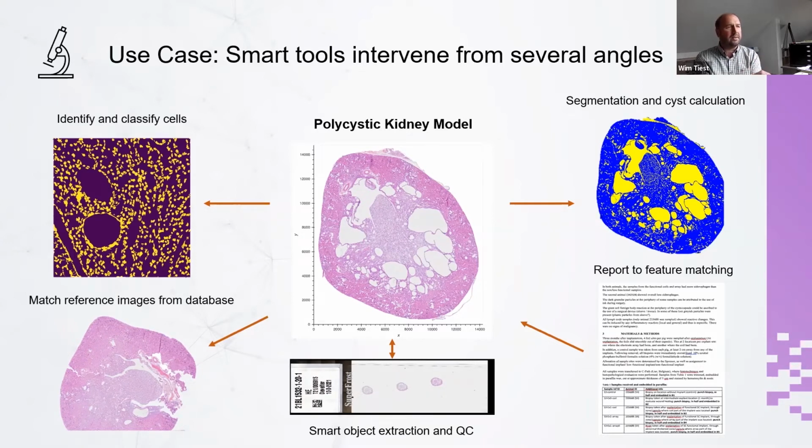The other example on the left side is an example of picking up cell nuclei, which is one of the base activities, I would say, in any pathology evaluation. Nuclei are the bread and butter of the pathology practice.